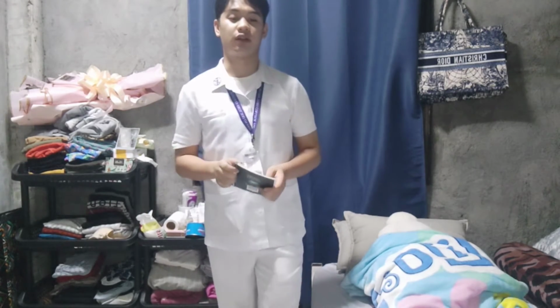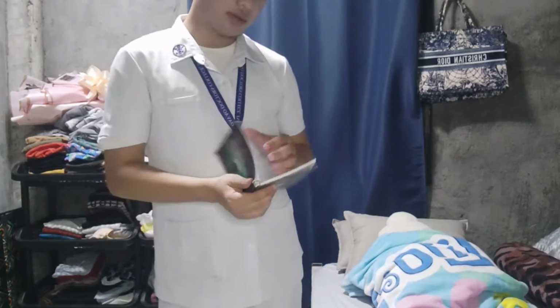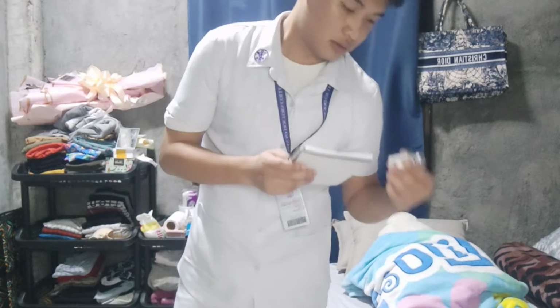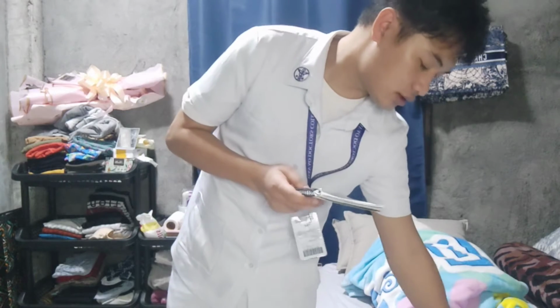Next, we need to check the medication administration record, or the MAR. Check the label of the medication carefully against the MAR to make sure that the correct medication is being prepared. This ensures the correctness of the medication. The medication I'm going to administer today is sterile water for injection, with a 1 cc syringe.